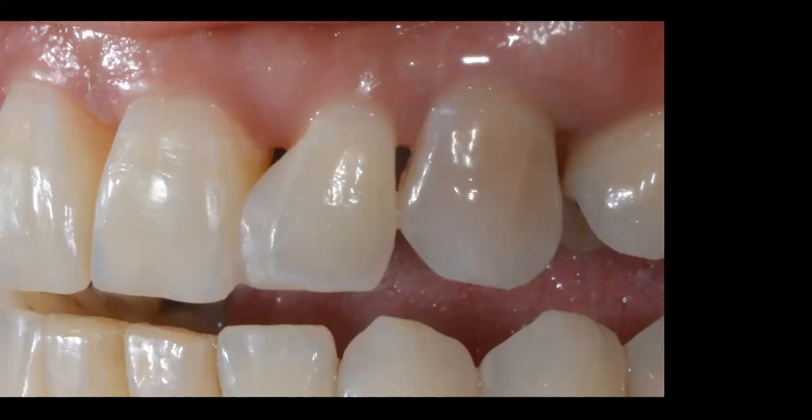That's a good question. So the answer to the other question, which is we need to change the emergence profile subgingivally. So here's the next question for everybody. How do you change the emergence profile subgingivally with composite? How do you reflect the soft tissue? How are you able to change the emergence profile subgingivally with composite? How does that happen?